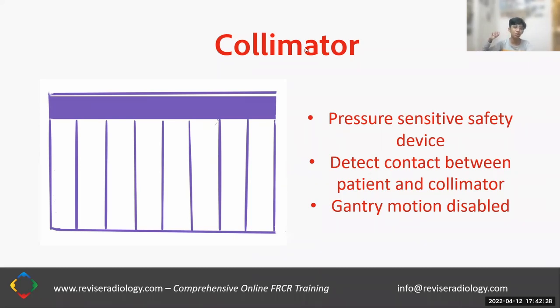So we are trying to have a type of camera head motion such that the patient-detector distance is as tiny as possible, which is not such an easy thing because the human body is not uniform. So this extremely complicated equipment has to move very uniformly and stably, but it also has to move in an orbit which is as close to the contours of the patient's body as possible.